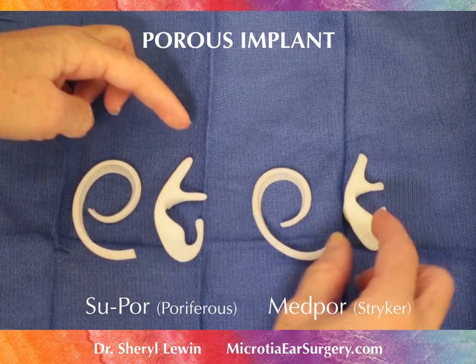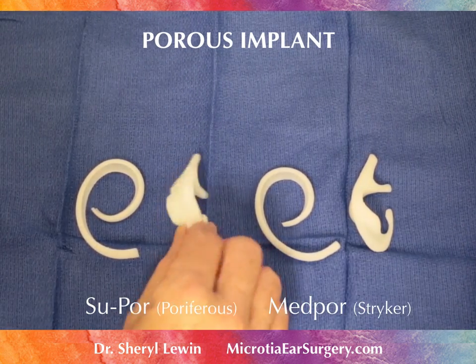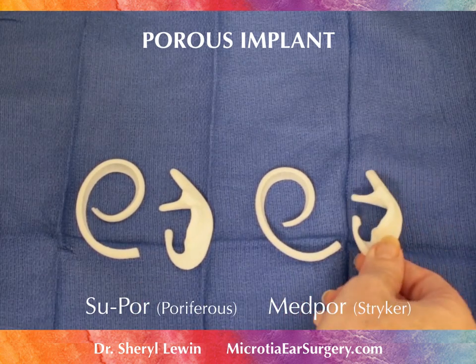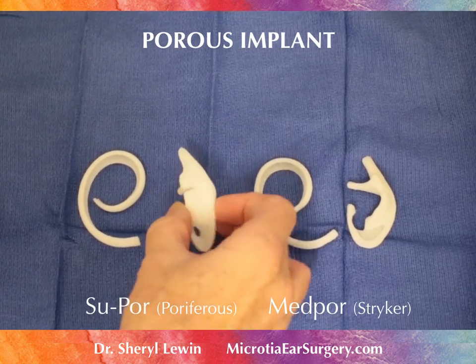This top piece is a little longer than the one on the MEDPOR, but that's not very significant. On the other side, they're very, very similar in appearance — just some minor differences.